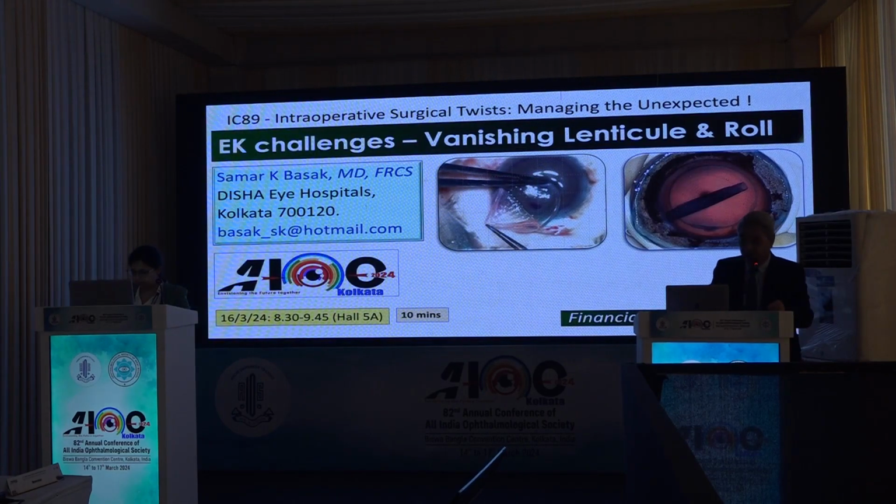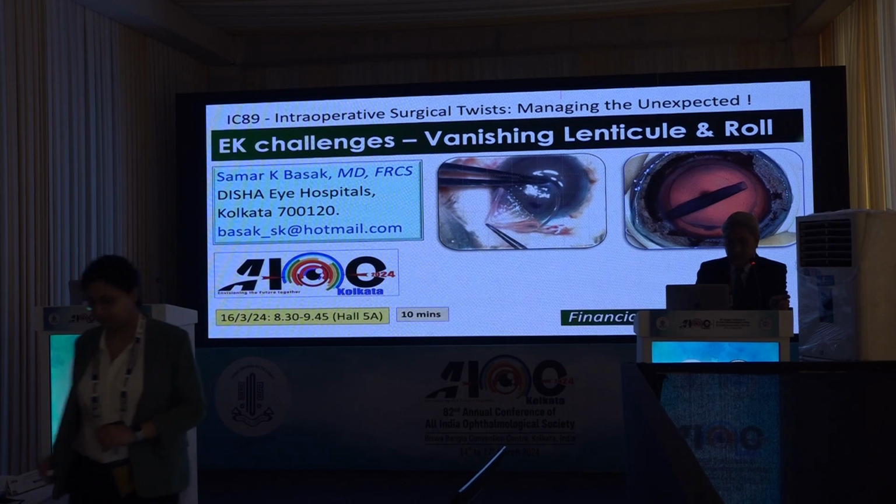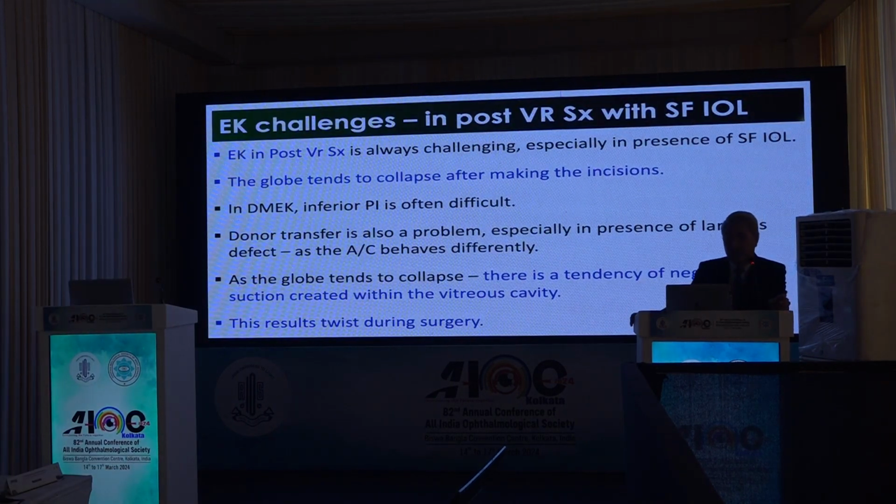I'll be showing two different scenarios in endothelial keratoplasty. One is the vanishing lenticule and another is the vanishing DMEK roll, and how we have rescued it. Both of these cases are in post-VR surgery with SFIOL.